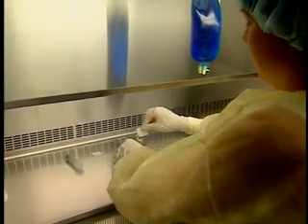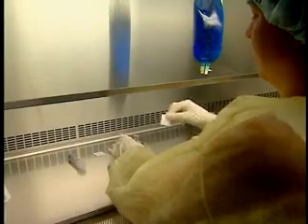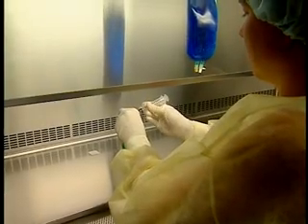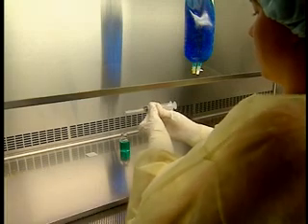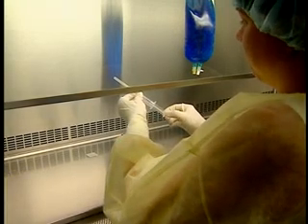Disinfect the rubber stopper of the vial and let it dry. Hold the syringe at a 70 degree angle and draw in a volume of air equivalent to the amount of solution to be withdrawn. Remove the needle guard.